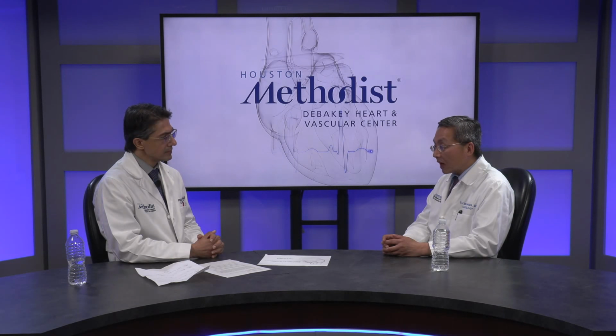Or you do MRI yourself, it's very similar to the stress MRI protocol and image quality. And the study has shown that it correlates very well with the stress MRI, for instance, for assessment of ischemia. The downside is you have to do 2 CAT scans, so you get double the radiation and double the contrast, although still within relatively acceptable radiation compared to, let's say, 2 days stress SPECT myocardial perfusion imaging.